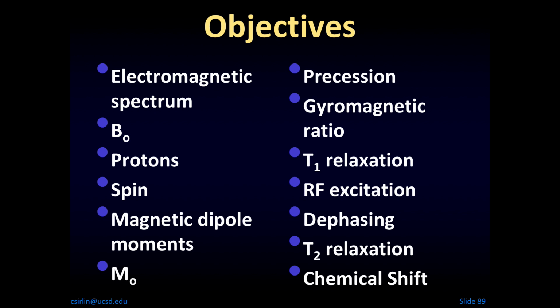But many patients with metastases probably won't respond very favorably to you calling them up and saying, Mr. Smith, I know that you have metastases and you're going to die in a couple of weeks, but I was thinking that you might want to come in so I can optimize my scanner. Would you mind doing that? So they may not like that. Instead, you can turn to your buddy and say, you're a perfectly healthy person, but you have this surrogate of metastasis called the spleen. So let me put you in the scanner, and I'm going to see what can make the spleen look different than your liver, and that's one way of optimizing your sequences by recruiting a healthy volunteer.